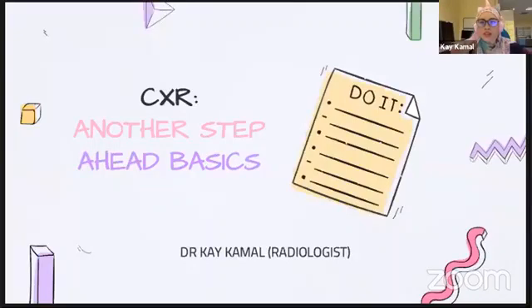Okay, Assalamualaikum and a very good evening, everyone. So today we'll be talking about chest X-ray. The other day I already talked about chest X-ray, but those are actually the basics. So this time around, I'll be more focusing on the mediastinum and also some parts of the pleura.